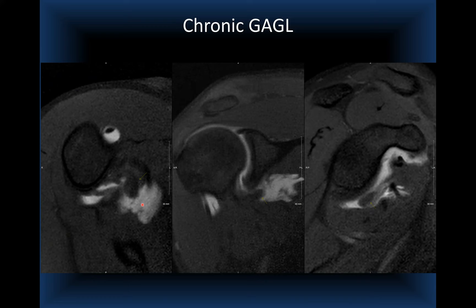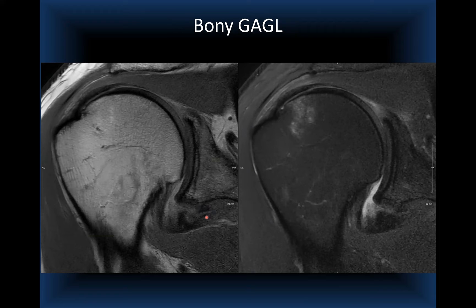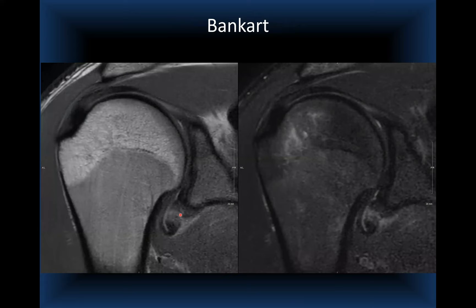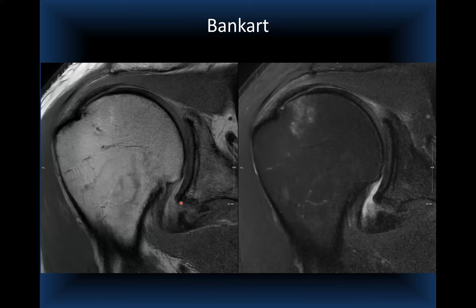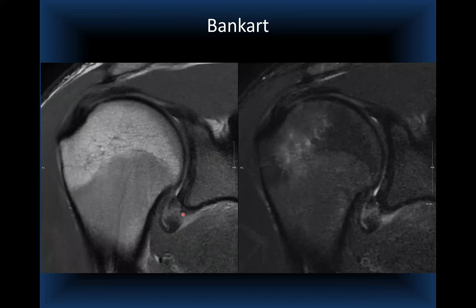A bony GAGL case also shows an intact labrum, bone marrow edema from the Hill-Sachs lesion, indistinctness of the scapular neck cortex, and a small piece of bone pulled from the glenoid insertion of the inferior glenohumeral ligament. This contrasts with a Bankart lesion where the labrum is abnormal and the entire anteroinferior capsulolabral complex is displaced. The key distinction: GAGL — normal labrum with capsular avulsion; Bankart — abnormal labrum with the entire complex detached.